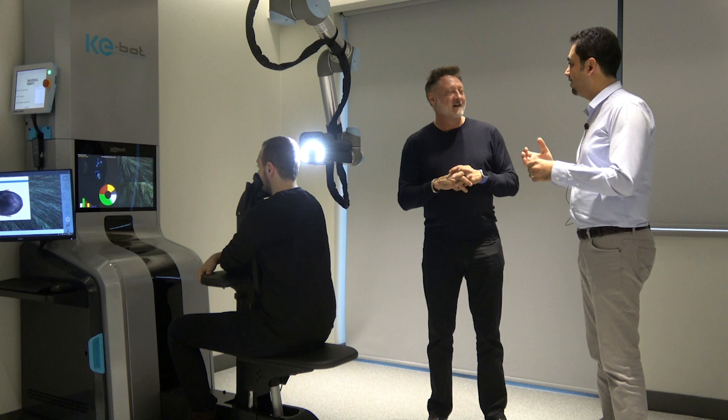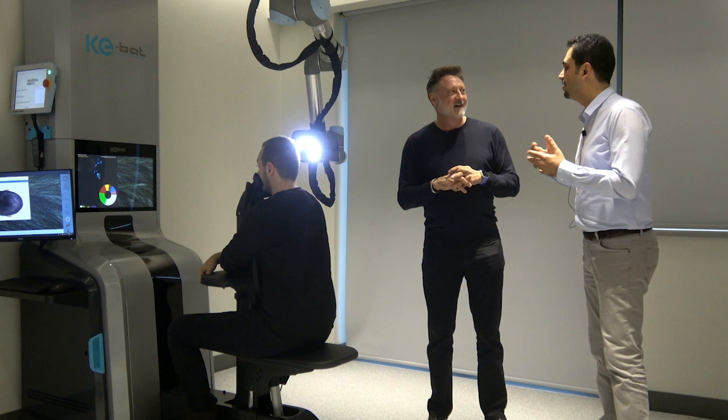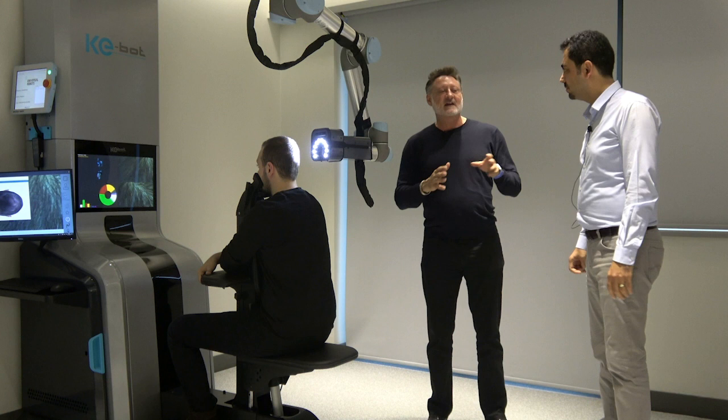You know how many grafts you have, how many hairs you have, how many hairs in each graft, and the thickness of each hair. You have all the data — it's up to your imagination what you can do using this data. It's absolutely unbelievable.